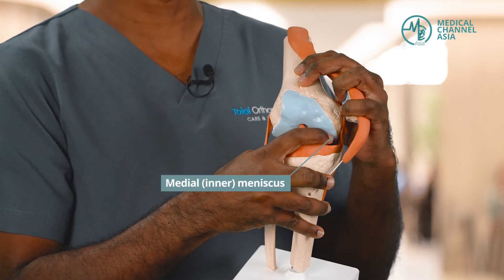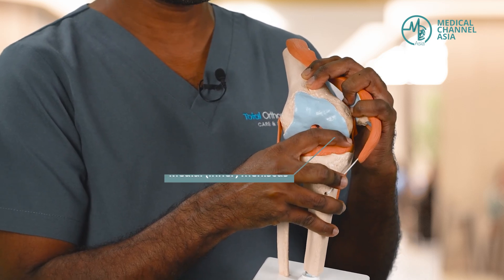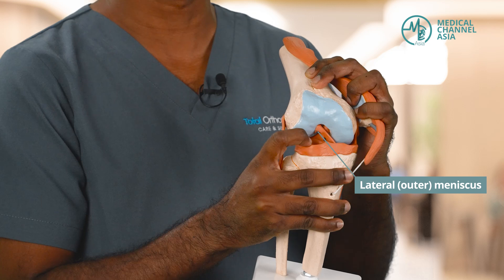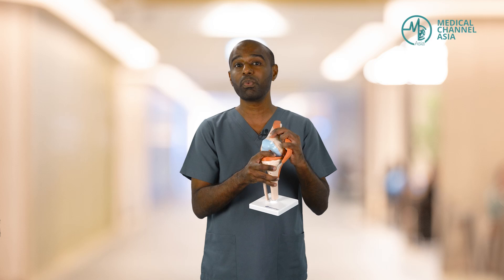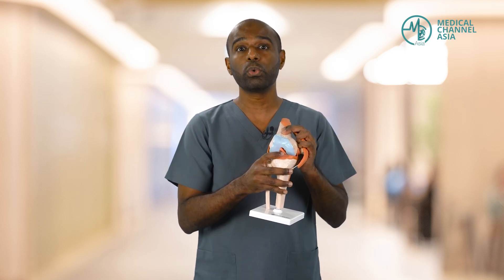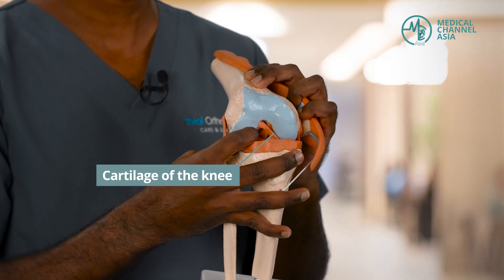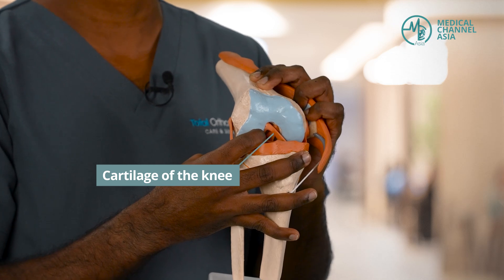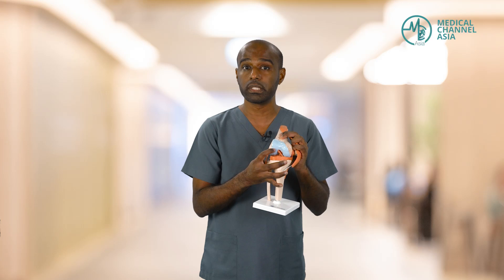At the sides, we have the medial — otherwise known as the inner meniscus, the shock absorber — and the outer meniscus, otherwise known as the lateral meniscus. We are also able to probe and look at the structural integrity of these menisci, to see whether there are any tears or degeneration present in them. Finally, we are also able to assess the cartilage of the knee, or the soft covering. This is a very important tissue — in fact the most important tissue in the knee — because once damaged, it does not have the ability to heal itself.